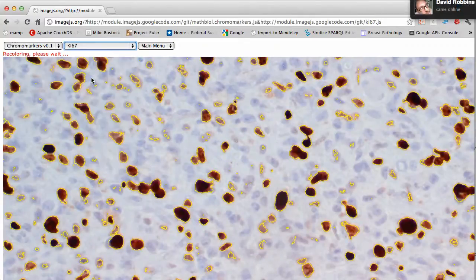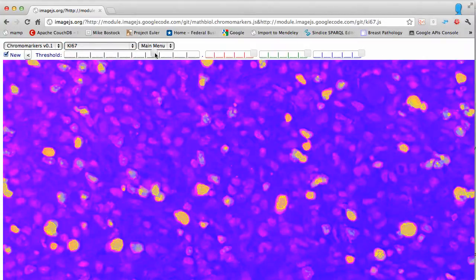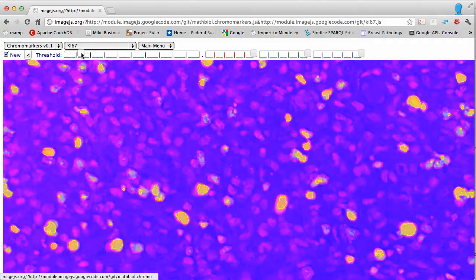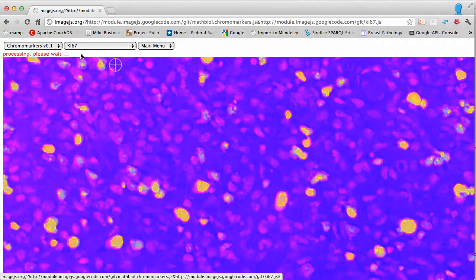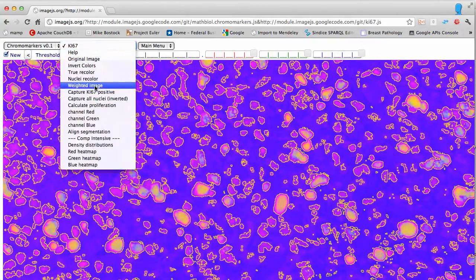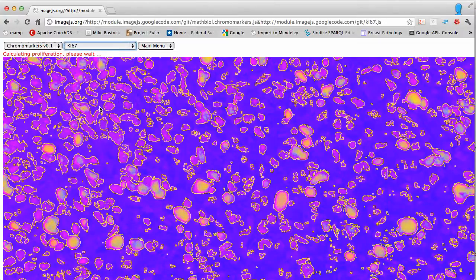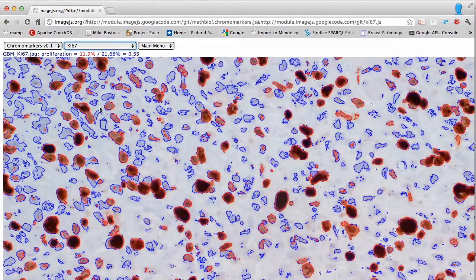Even if the image is clear, use the nuclei recolor operation to separate the nuclei from the background. Choose the background and decrease the threshold. This looks good enough — capture all nuclei. Within less than 30 seconds you are able to calculate proliferation and document this calculation with the original image with the segmented regions highlighted in it.